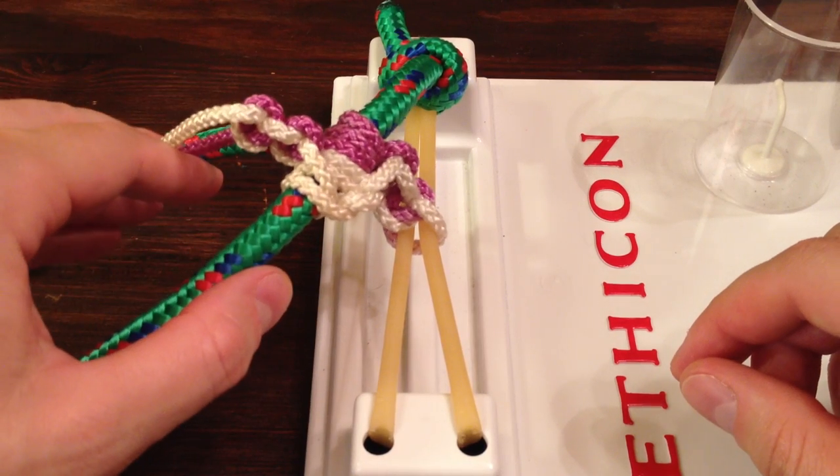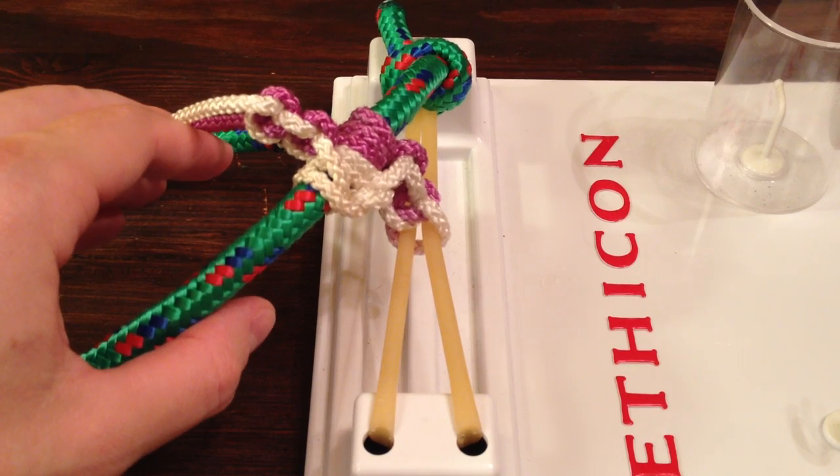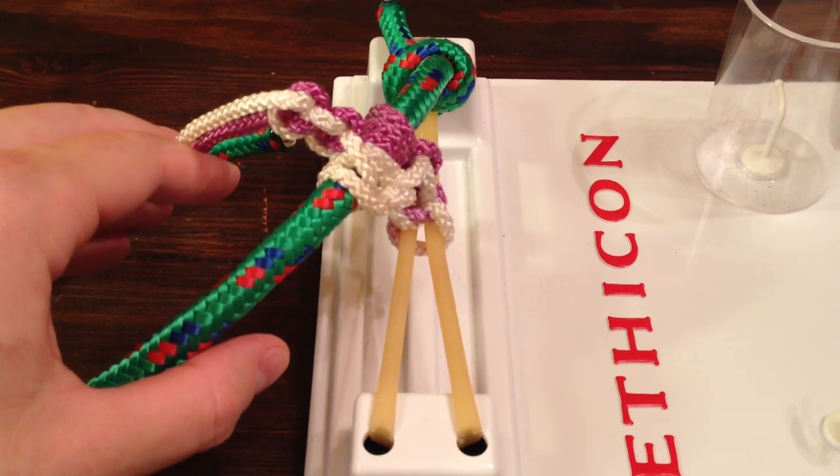And that's it — that's the EZL drain stitch. It's quick, it's easy, it looks pretty, and it holds really well, allowing all that nasty stuff to drain out.